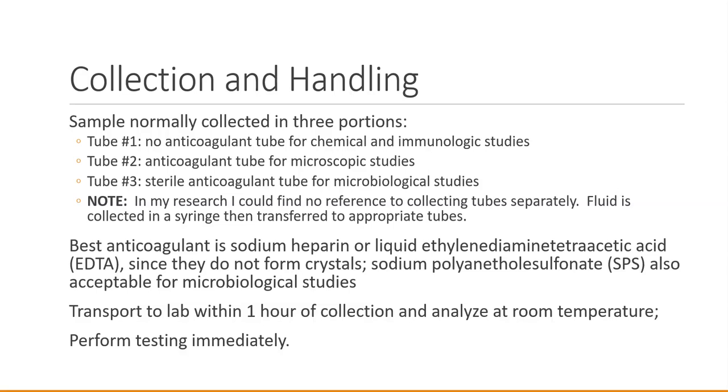The best anticoagulant is sodium heparin. What is the color stopper? Green. Or liquid EDTA. What is the stopper color? Purple. Since they do not form crystals. SPS is used for microbiological studies. You want to transport the sample to the lab within 1 hour of collection and analyze it at room temperature. Testing should be performed immediately.